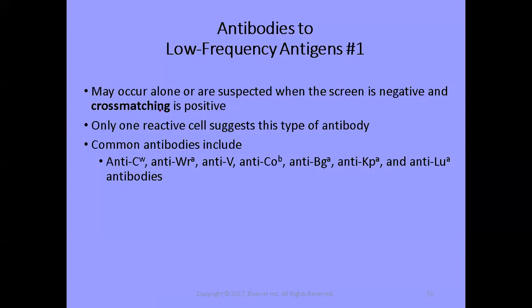So we haven't talked about the cross-match test yet. It'll be coming up in module 3, no, exam 3 material. We're in module 3 now. It's kind of hard to keep track of it. But let me just tell you a little bit about the cross-match test.